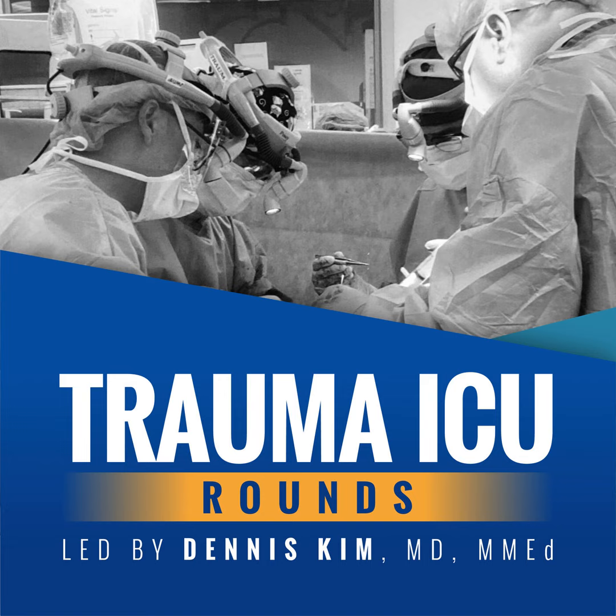Other measurements that may be used include the tidal volume, which we typically like to see around 5 cc's per kg. Other measurements include measurements of the load on the respiratory system, such as minute ventilation, which we typically expect to be in the 5 to 6 liters per minute range, or 1 liter per 10 kilograms.